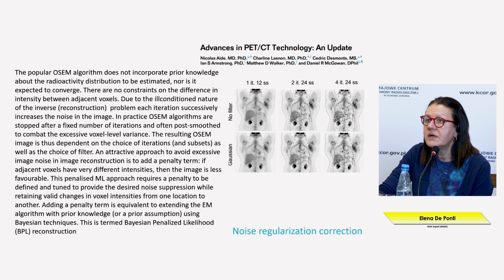And so if we increase too much the number of iterations, we will get very noisy images.